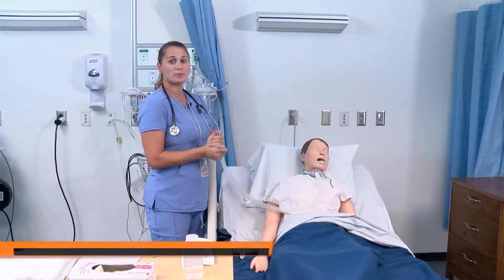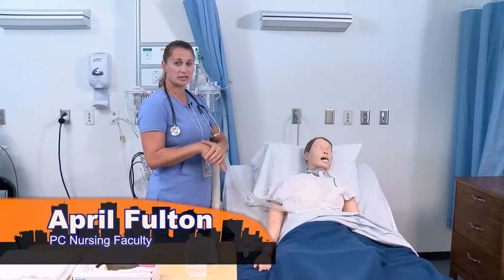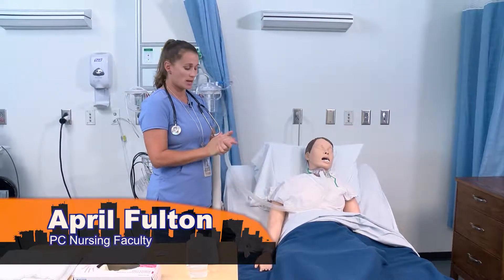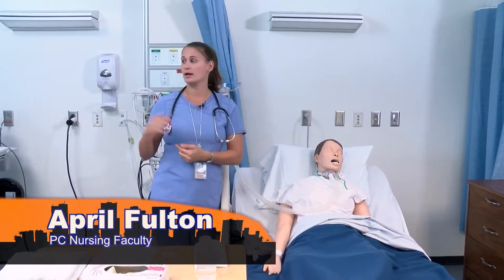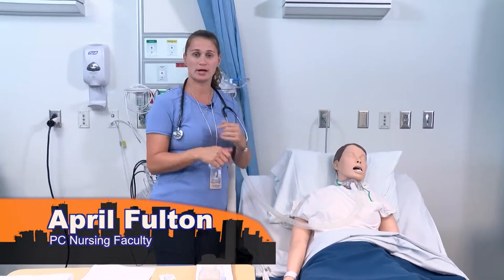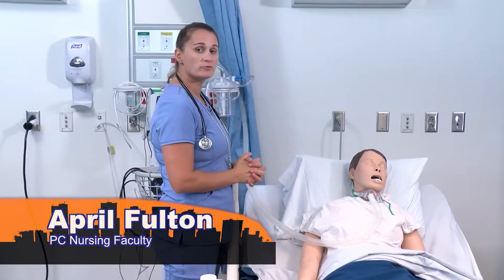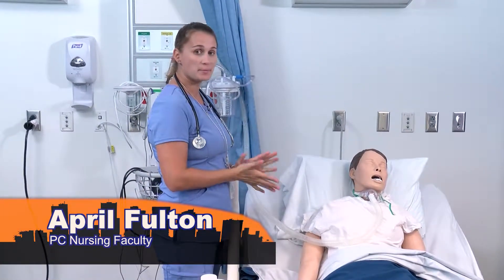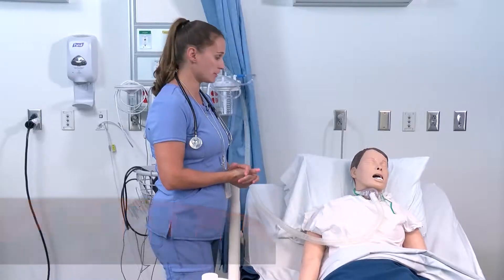I'm going to start by showing you tracheostomy suction. I just washed my hands and provided privacy with a curtain. I'm going to first identify my patient and introduce myself.